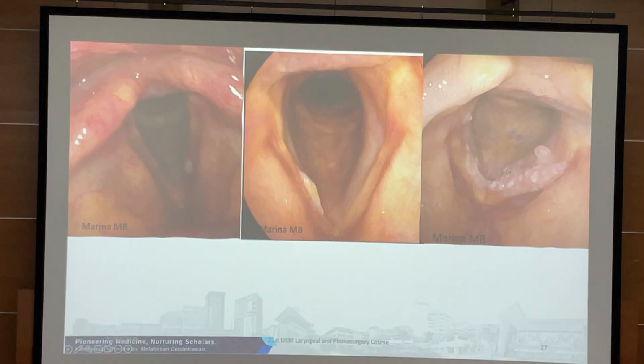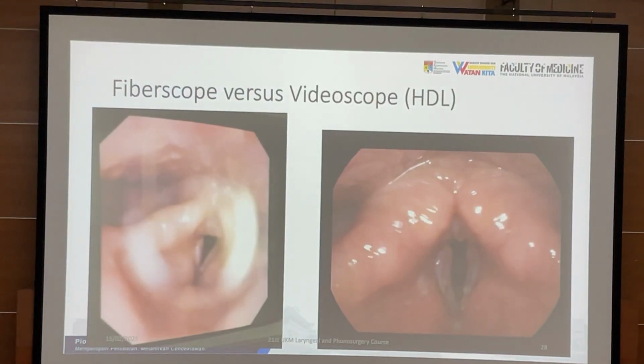How about that one? The patient is a doctor, who claimed that this is just a leukoplakia, don't do anything, because he had the same surgery 5 years ago and it was reported as leukoplakia, just dysplasia. But I told the patient this is irregular, and I will show later on there is change of vasculature, and I convinced the patient to have the surgery, and it turned out to be squamous cell carcinoma. So remember I said at least you must have a videoscope.